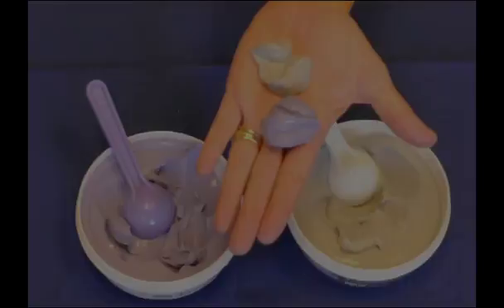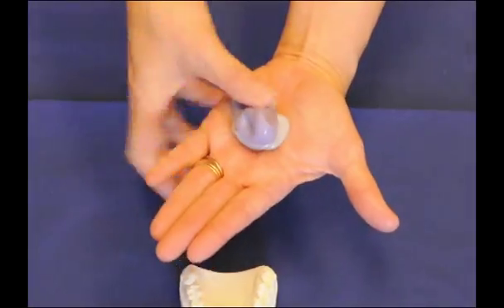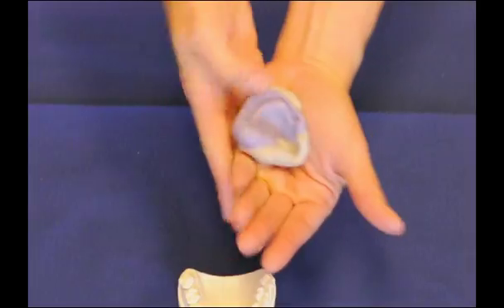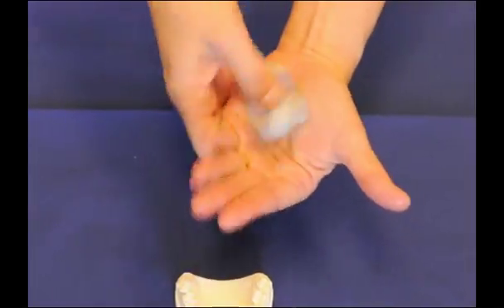I like the Flexi-Time Putty, as it's a putty-putty system, and it has some flexibility even after cured, which makes it perfect for a reduction matrix.